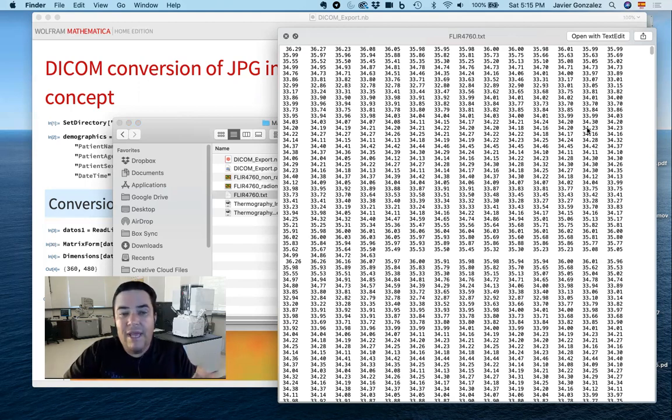So those two elements, I can insert them into a DICOM file as different frames. So when I read it with my proprietary reader, which I haven't done, which is basically the PACS system, well, with that you can read the radiometric file and see it and do whatever you want with it.